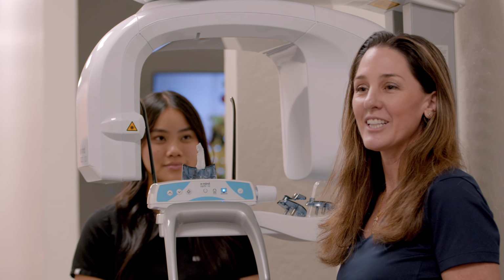Once we have Vicki at the machine, we want to make sure that we're not too high or too low so she could step in appropriately without hitting her head. So go ahead and Vicki, step on in, and I'll have you either hold your hands at the very bottom, or if you're again worried about shoulders, go ahead and take your hands to your palm and you can set them right there, and that will kind of help pull your shoulders down.